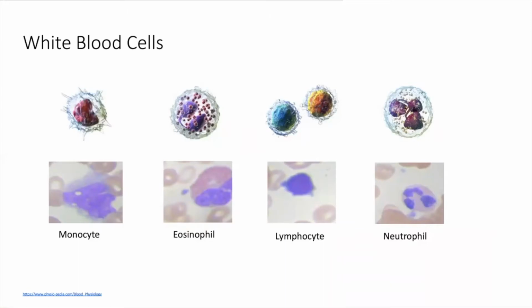These are both motivations for our project to create an effective and reliable machine learning model, replacing human labor in identifying and categorizing various cell types in the blood sample with different nucleus structures into four groups: monocytes, eosinophil, lymphocyte, and neutrophil, thus dramatically increasing the efficiency and accuracy of clinical diagnosis.